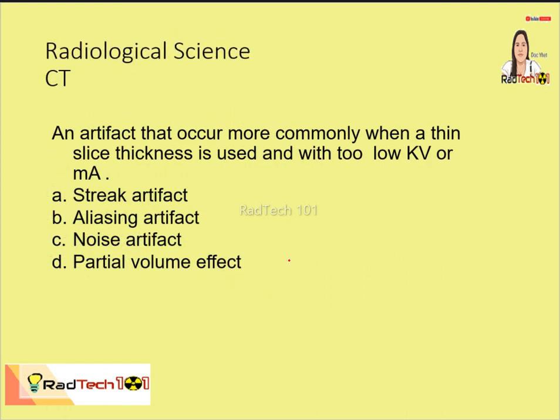Next, an artifact that occur more commonly when a thin slice thickness is used and with too low kV or MA. Di ba? Pag masyadong mababa ang MA natin, so low number of photons produced, therefore it will result to noise artifact.